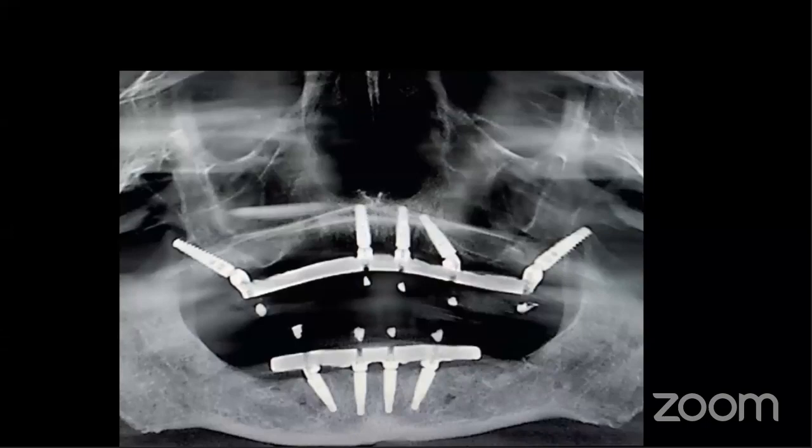And the fewer complications and the fewer problems you have to deal with, the better for you and the better for the patient. And so if we need to place extra implants, then we just place extra implants. Now, if something fails afterwards, then you can get into the situation where you need to place additional rescue implants. And that's where we'll ask the patient, do they want one or two? And again, we don't charge them for any of that.